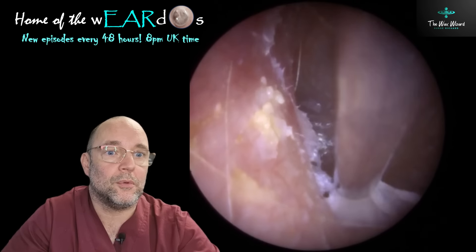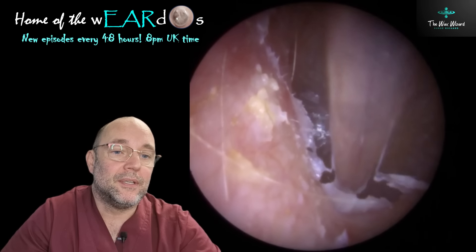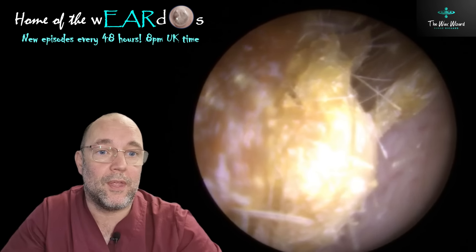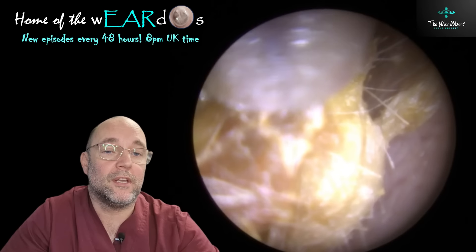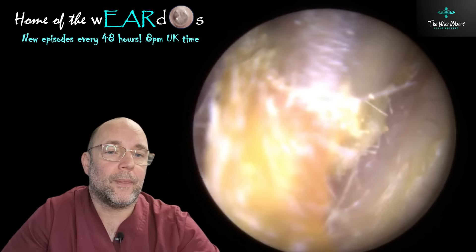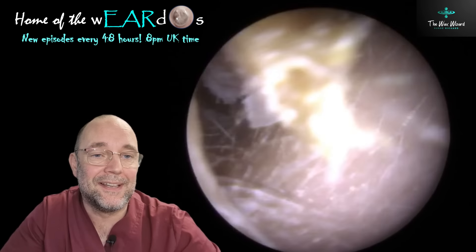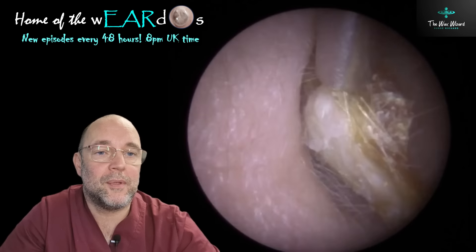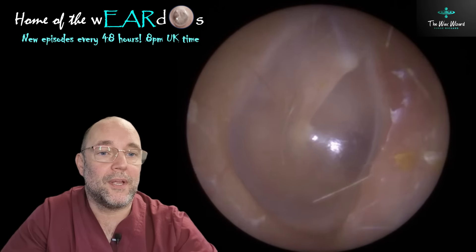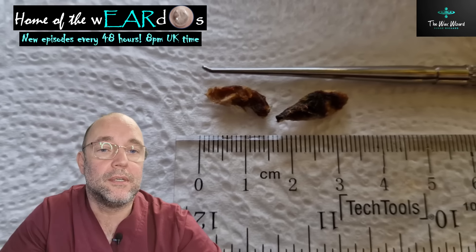The other one thankfully wasn't as much trouble as this one — or maybe not thankfully, I know you like watching me struggle with the more epic ones. I think we're pretty much reaching the end of where it's safe to remove everything, and I'm more than happy with what we've got there. You probably shouldn't try to get every little speck unless it's safe to do so. This other one is not quite as black, so it's quite a fair bit easier to get out — in fact a couple of little shakes and out it popped. I have been trying to remember to take some images of the plugs we're removing so you can see them afterwards. Thankfully no sticky chewing gum behind this one.